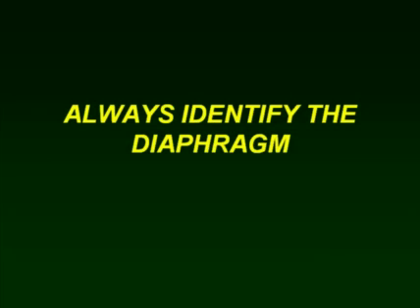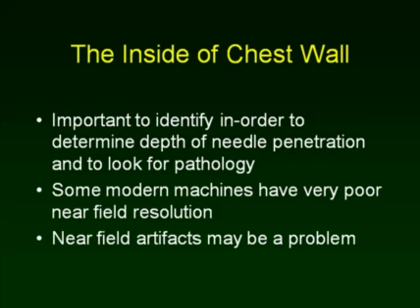However, it's the responsibility of the bedside ultrasonographer to always emphasize, always identify the diaphragm when searching for pleural effusion, and by implication, when identifying an appropriate site for device insertion. Always identify the diaphragm.